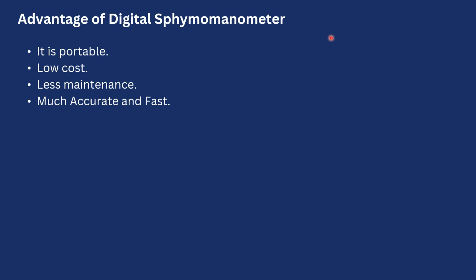Let's come to the almost second last slide, the advantages of the digital sphygmomanometer. It's portable, handy, easy to carry, low cost, less maintenance, much accurate and fast.